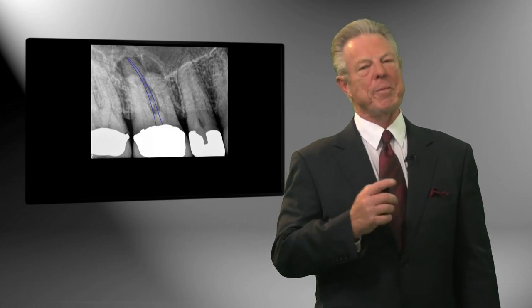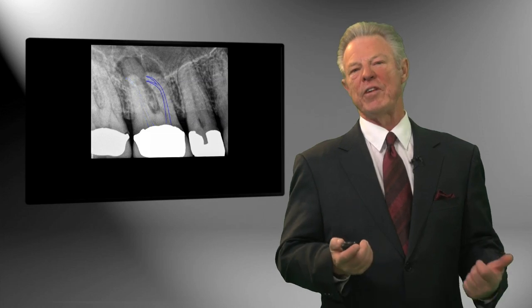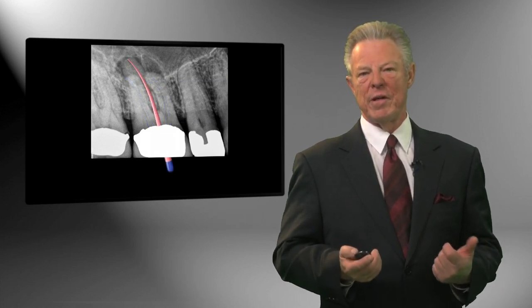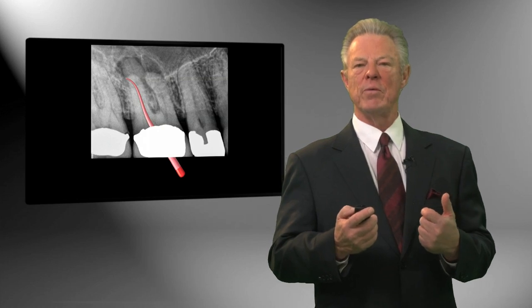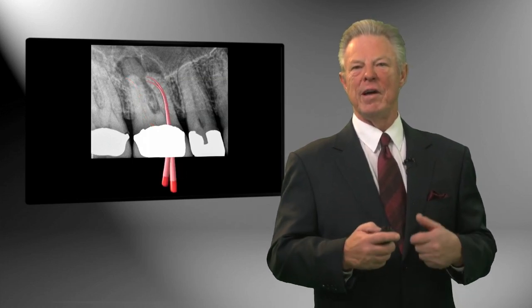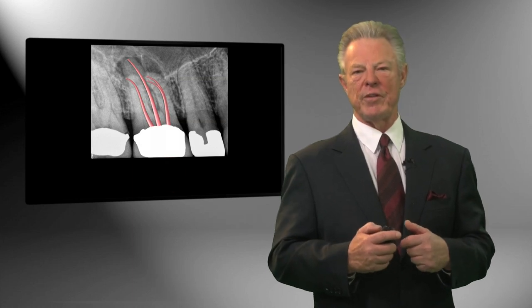We imagine the shape of the palatal. The DB goes a little bit to the turn. How many mesial buccals? Let's just say there were 2. So imagine this. This is all in our imagination. The cone fit. When am I done with the shape? When the cone fits. And let's make 2 mesial buccals. And so there's our image of the cone fit.